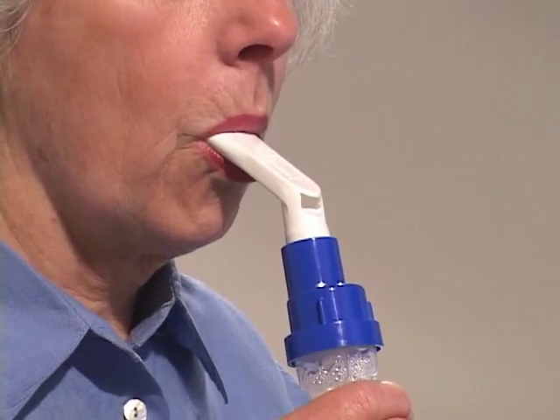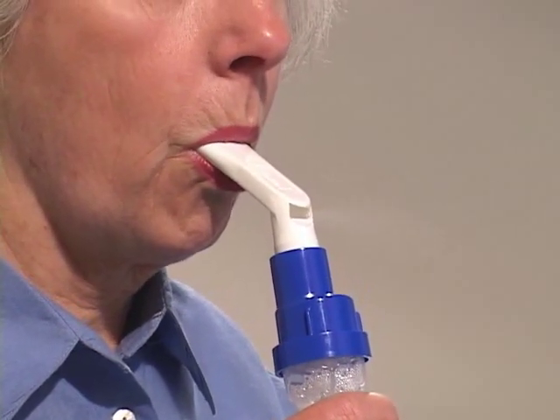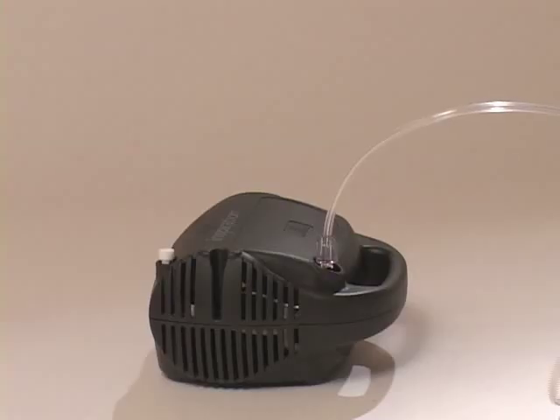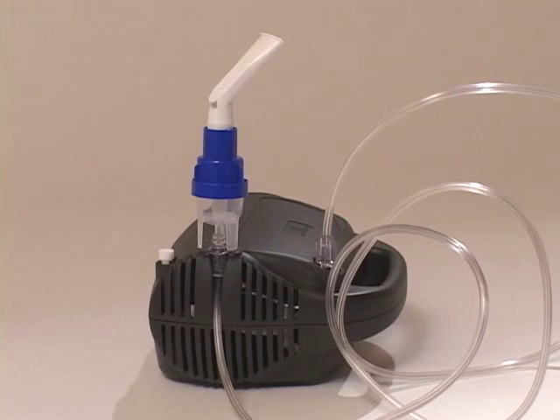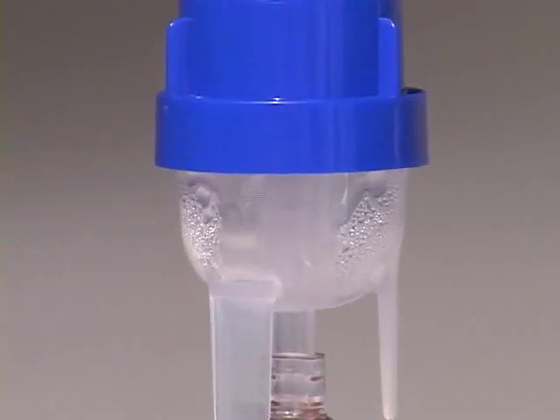Place the mouthpiece in your mouth. Be sure you're in a relaxed, upright position. Remember to breathe through your mouth, not your nose. It's important to get the medicine into your lungs. Take two or three slow, deep breaths between normal breaths. If you need to stop before the treatment is complete, turn off the compressor and place the nebulizer in the holder on the compressor. Usually the process takes about six to eight minutes. You'll hear a sputtering sound when it's time to stop and the mist will stop coming out. You may need to tap on the side of the cup to be sure you get as much medication as possible.